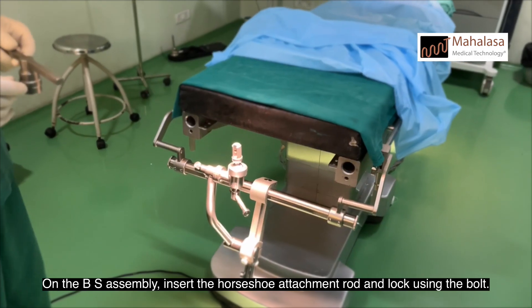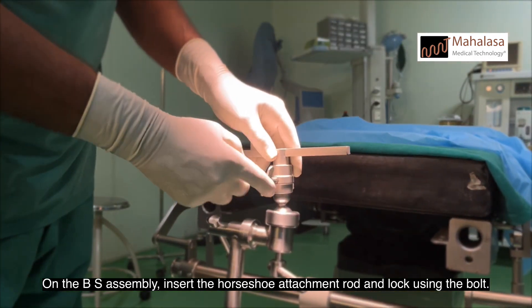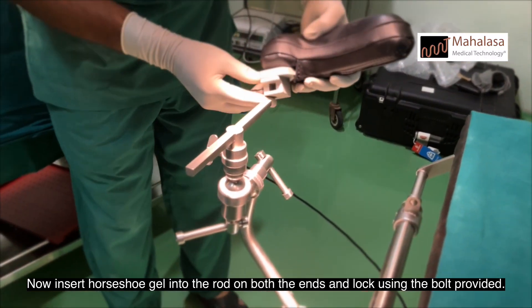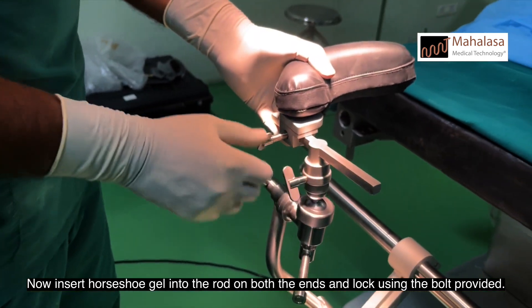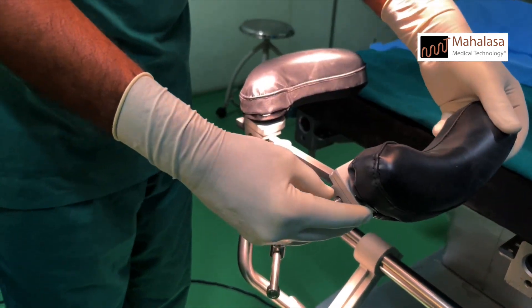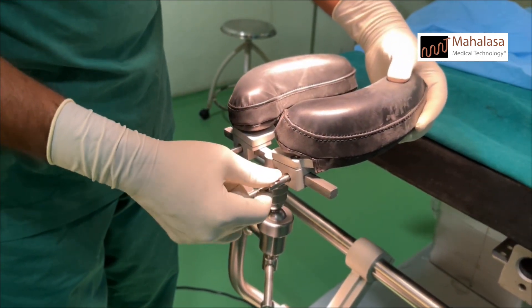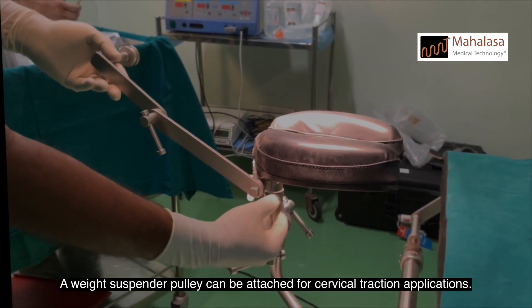On the BS assembly, insert the horseshoe attachment rod and lock using the bolt. Now insert horseshoe gel into the rod on both ends and lock using the bolt provided. A weight suspender pulley can be attached for cervical traction applications.